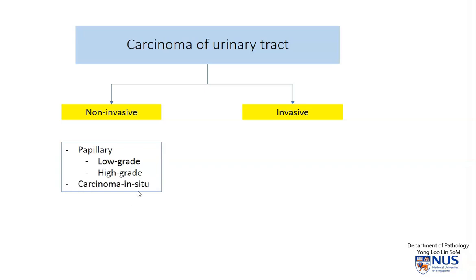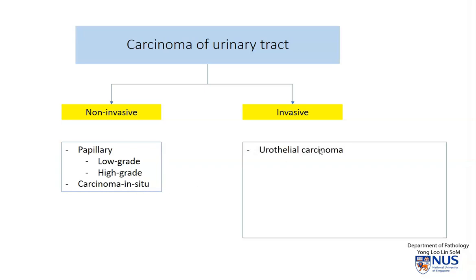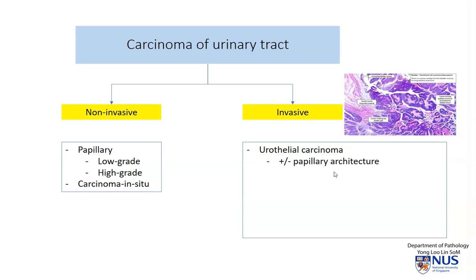There is also carcinoma in situ, where the basement membrane of the bladder mucosa is not yet breached. Among the invasive tumors, the commonest histologic type is urothelial carcinoma, and this may or may not have a papillary architecture. This is an example of a papillary architecture, where you can see towards the lumen of the bladder it is very papillary with these fronds. This pink area is the muscularis propria, so it is clear that this tumor is invading into the bladder wall.